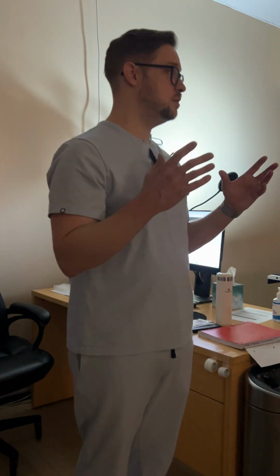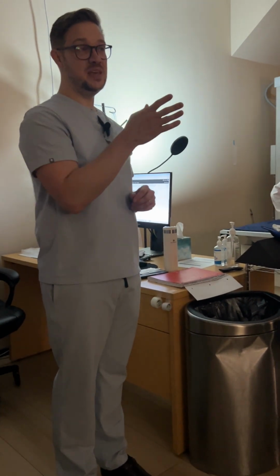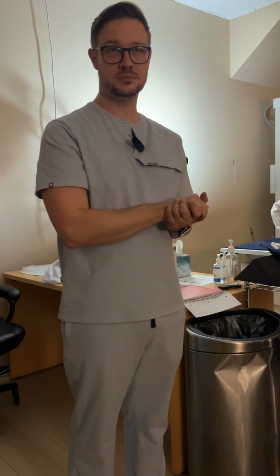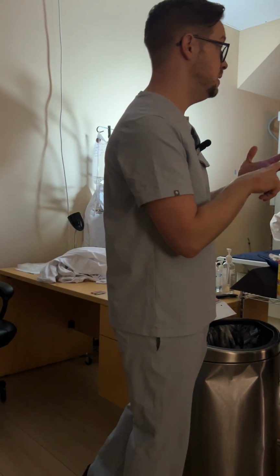KUB. Most of the time it's going to be an acute abdominal series. An acute abdominal series, or AAS, includes a PA chest, an upright abdomen, and a KUB. Okay? Questions? Make sure you know that. What was the three again? PA chest, upright abdomen, KUB.